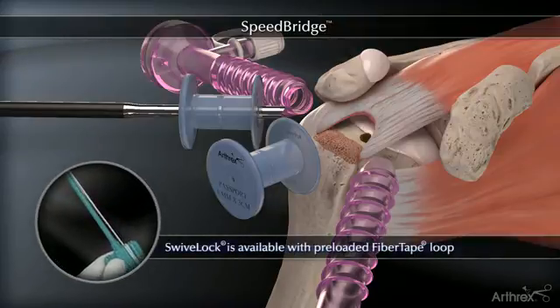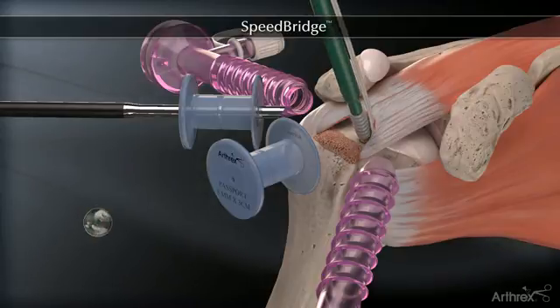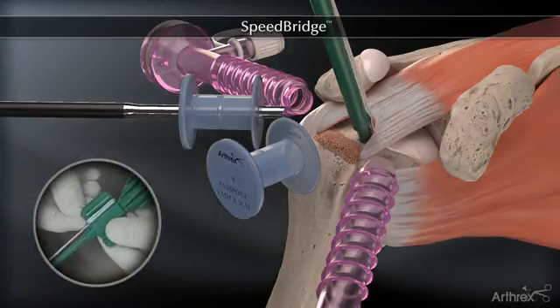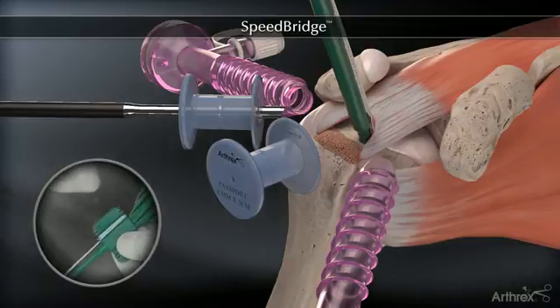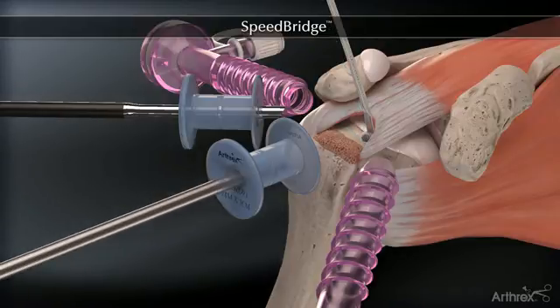The swivel lock is available with a convenient pre-loaded fiber tape loop. The swivel lock is inserted by holding the thumb pad steady while rotating the driver handle. The pre-loaded fiber tape loop is released from the thumb pad and the number two fiber wire tip retention suture is discarded.